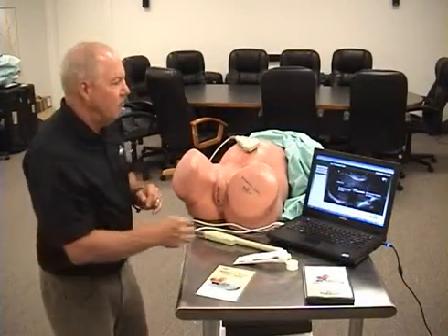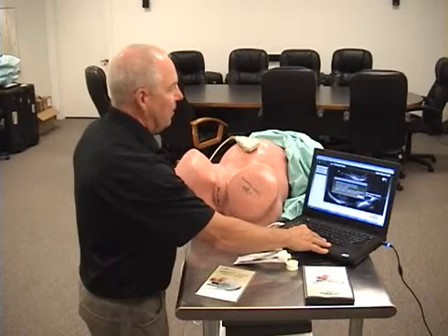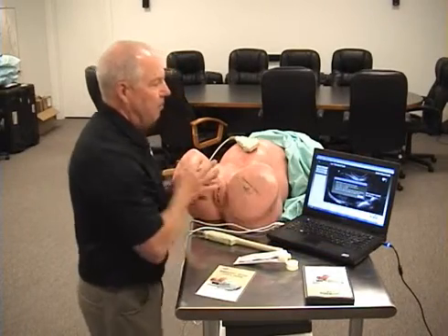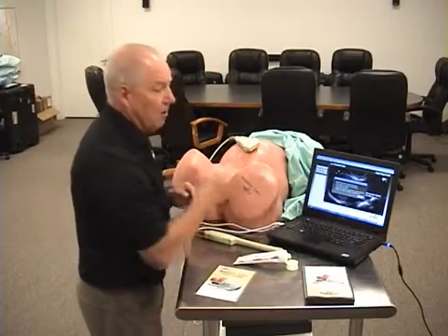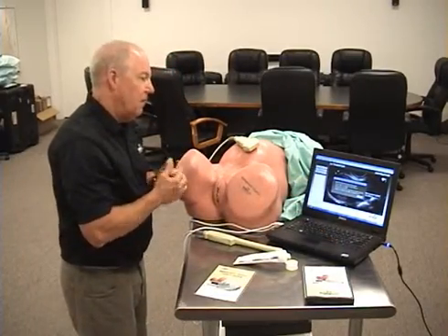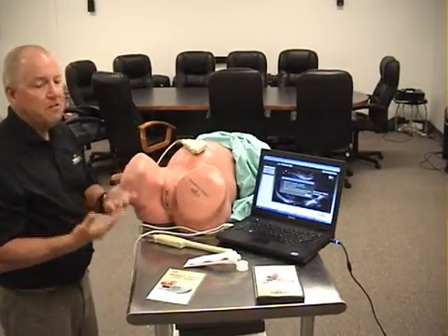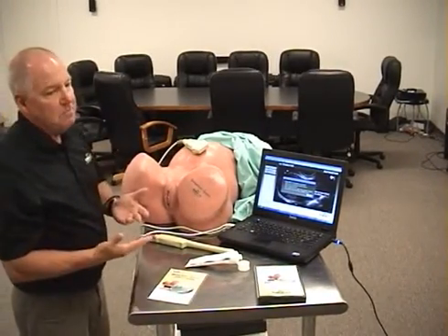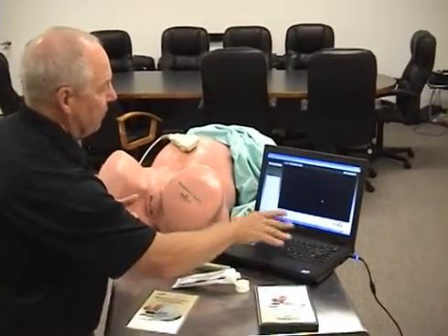So now what I'd like to do is move it over to the student mode. In the far left-hand corner, you press on student. You then have a short little introductory to what the student will be doing. This really takes all of the scans into a random mode. So press OK, that pulls that away.